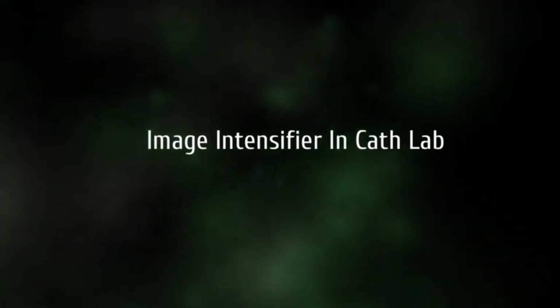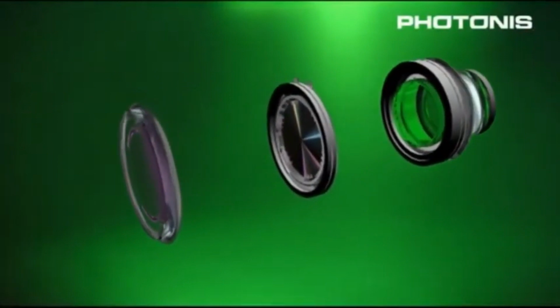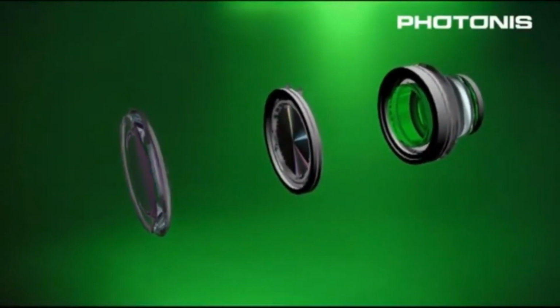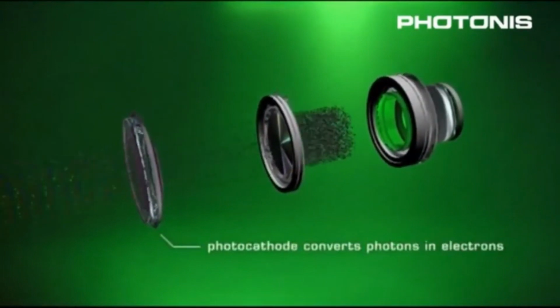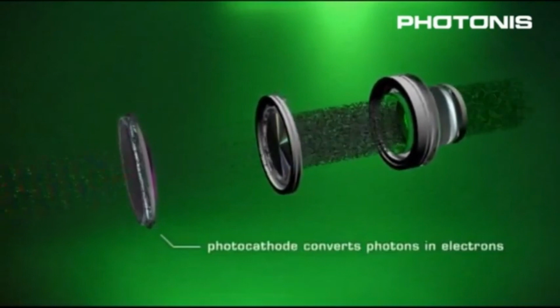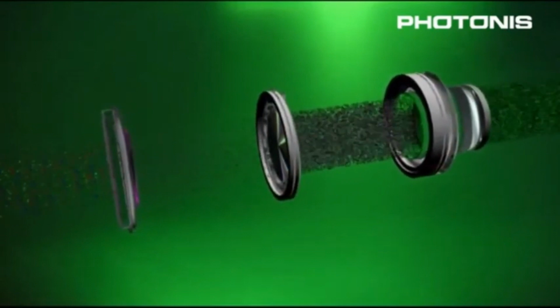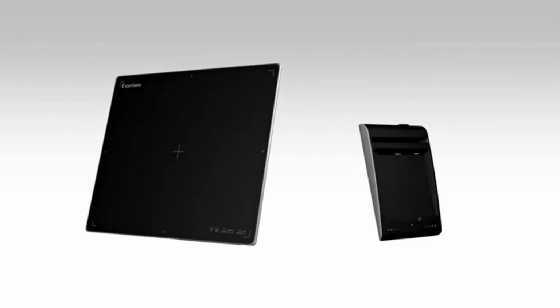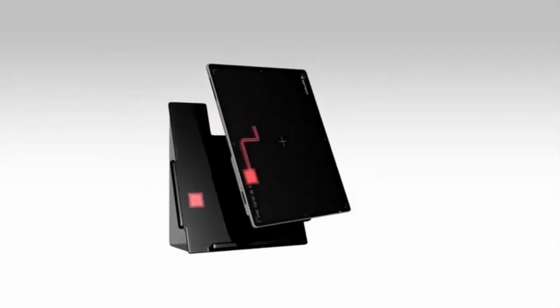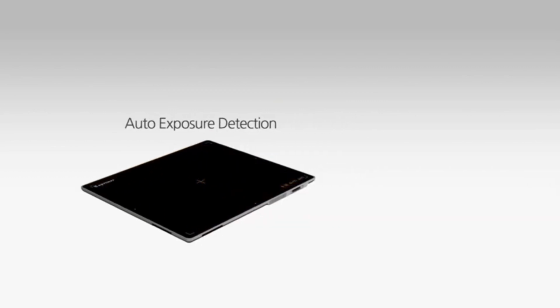Intensifier in cath lab. Image intensifier tubes, or IITs, are optoelectronic devices that allow many medical imaging devices to function. They convert low levels of light from various wavelengths into visible quantities of light at a single wavelength. Image intensifiers convert low levels of light photons into electrons, amplify those electrons, and then convert the electrons back into photons of light. In older cath lab systems, an image intensifier is used, but in newer models, a flat panel detector is the modern cath lab part which replaces the image intensifier.